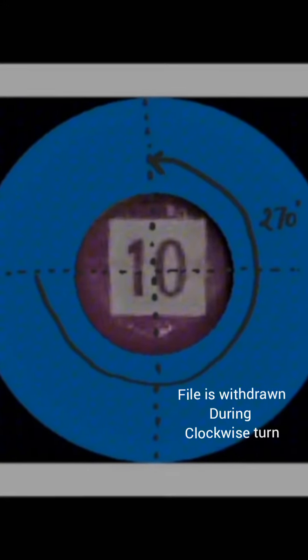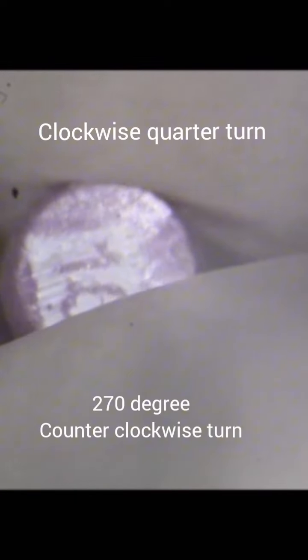This is followed by another clockwise motion of a quarter turn — around 45 to 90 degrees — with minimal apical pressure, and immediately followed by a counter-clockwise movement of 270 degrees maintaining apical pressure. This completes another turn. Three such similar turns accomplish one cycle: a clockwise quarter turn followed by a counter-clockwise turn of 270 degrees.